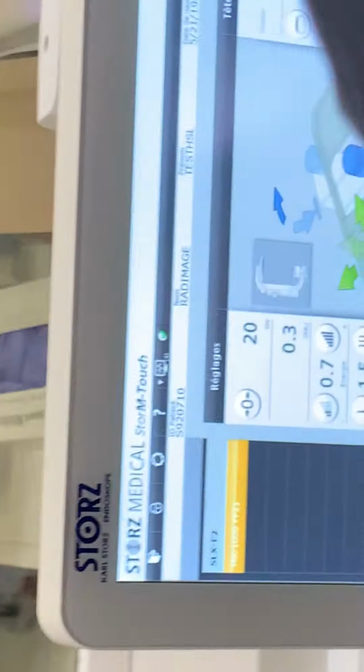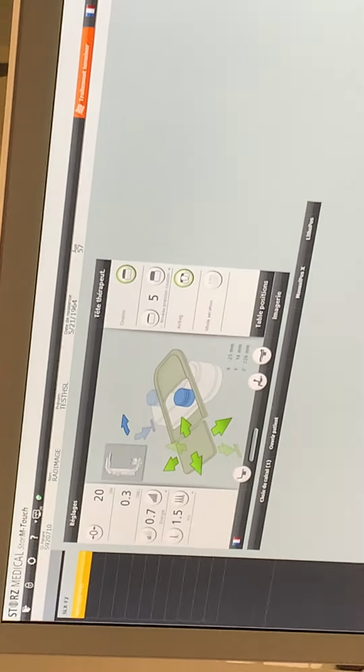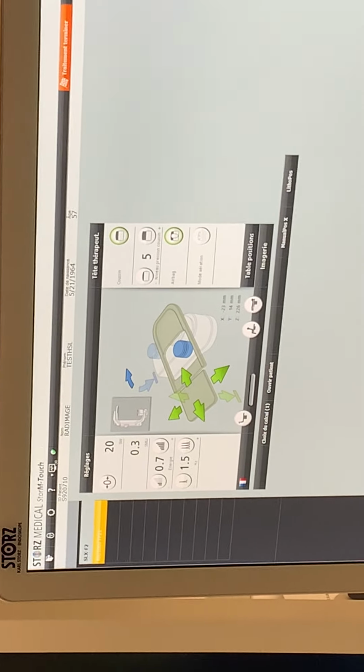Excuse me? I'm so sorry to ask, for the cushion, normally we would manually inflate with a button two different levels, 1, 2, 3, 4, let's say. Is this level set up to 5? This is our pre-adjust level where we are doing 90% of the cases. Yes, the airbag is automatically on, and our collimator collimates to the right side for the therapy head by itself.